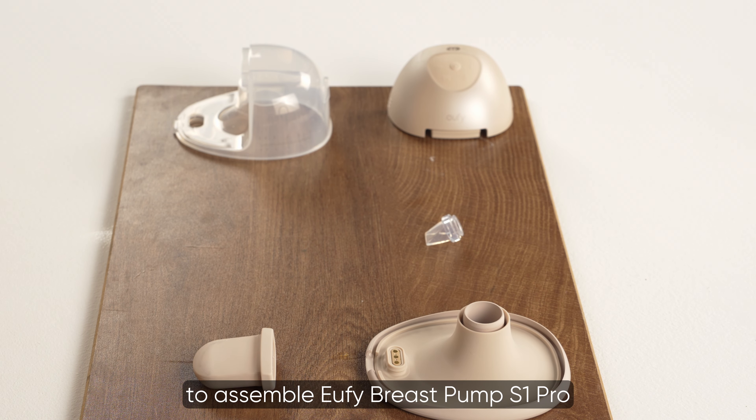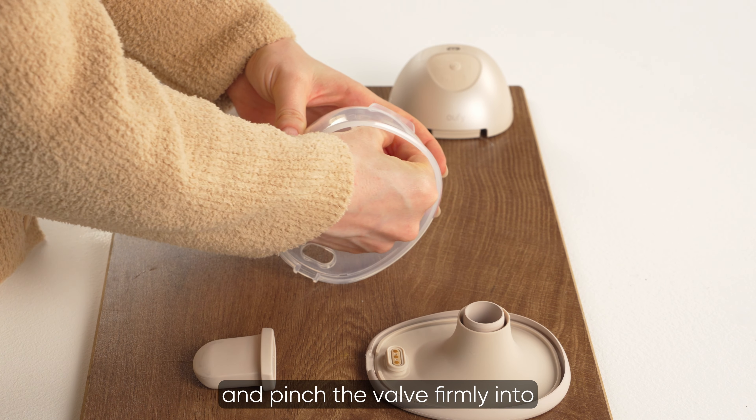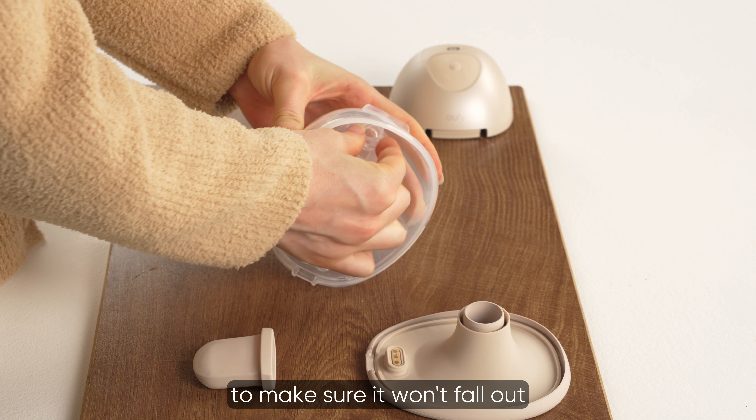There are four steps to assemble Eufy Breast Pump S1. Hold the container bottom and pinch the valve firmly into the hole inside the container to make sure it won't fall out.